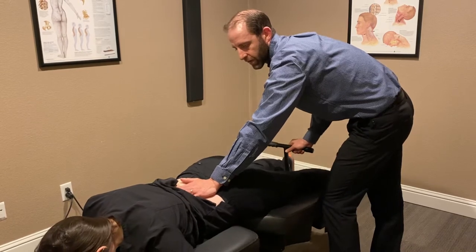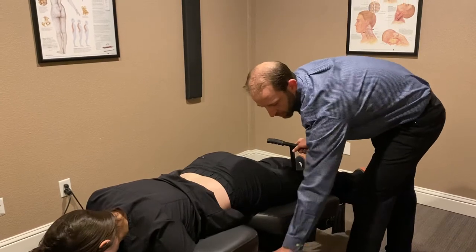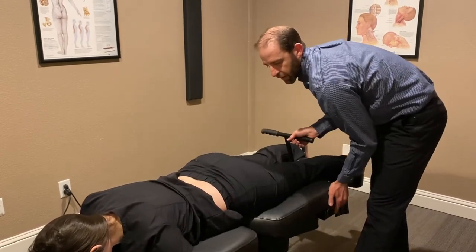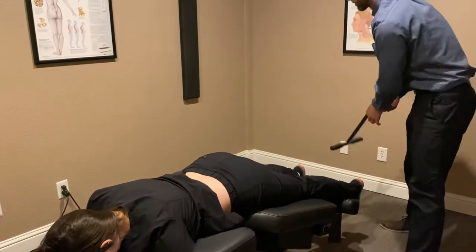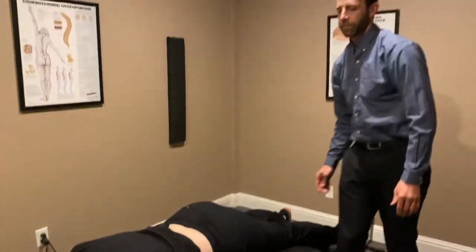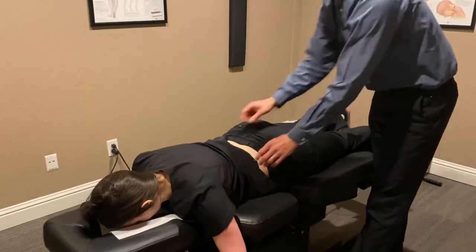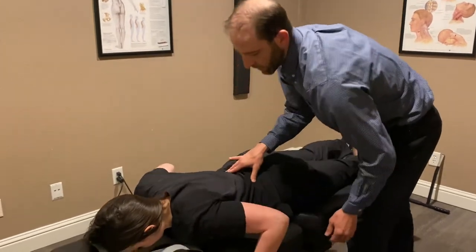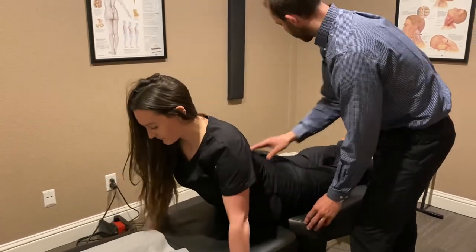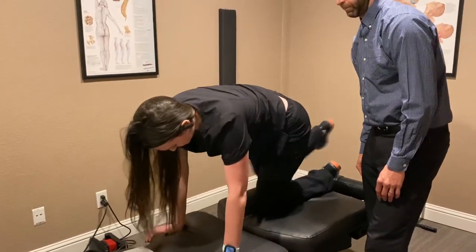When we're done — this is a very shortened session — we usually let the patient just relax on the table and lock everything in place. It has to go through another cycle. Then when you're ready, go ahead and push yourself up with your hands, lock your core in, and then roll on your side. Thank you very much.